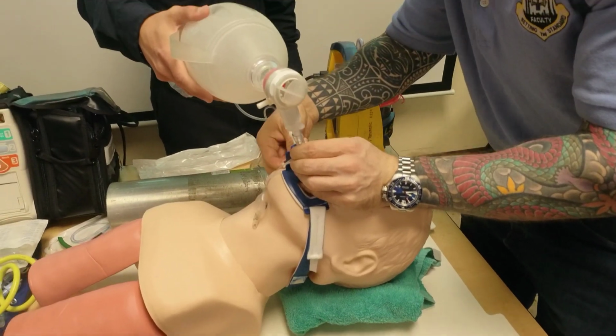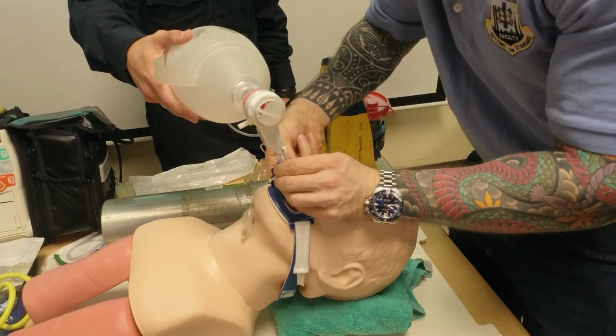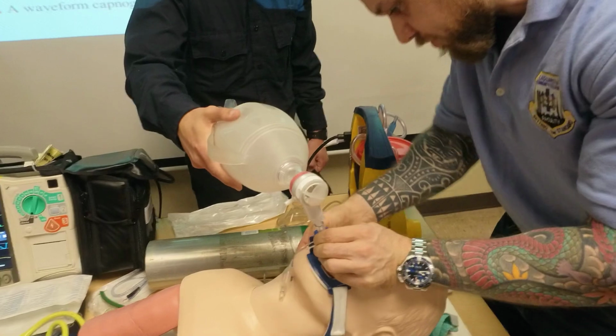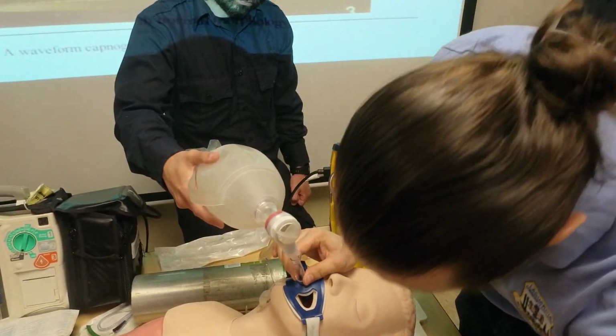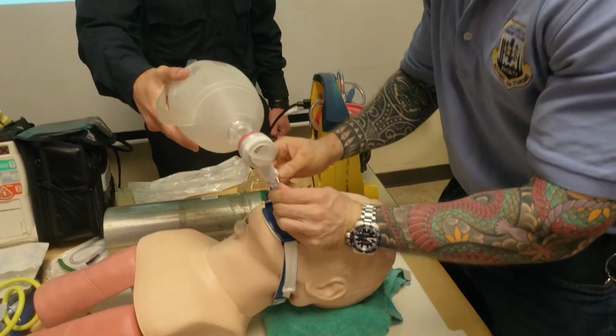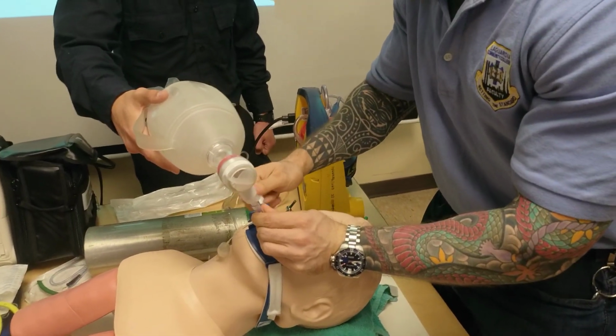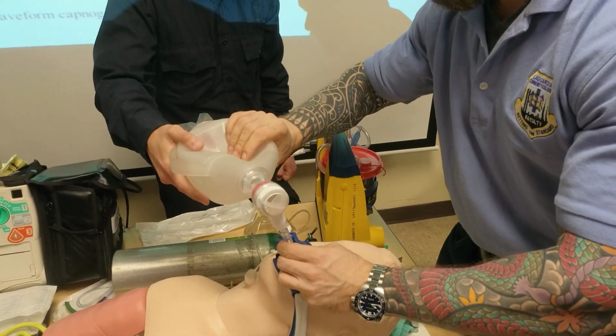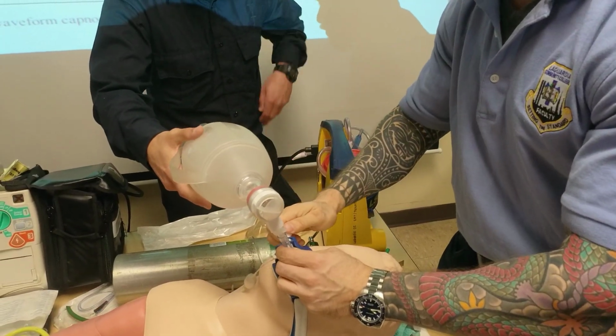Right? This device they already used. There's usually a longer strip on it that you could grab. It will facilitate ease of adjustment, but for now it's fine. Make sure both sides are secure. Once I'm comfortable with both sides, I then do what? Secure, but not to the point you clamp it. Right? I want to have what? Air.